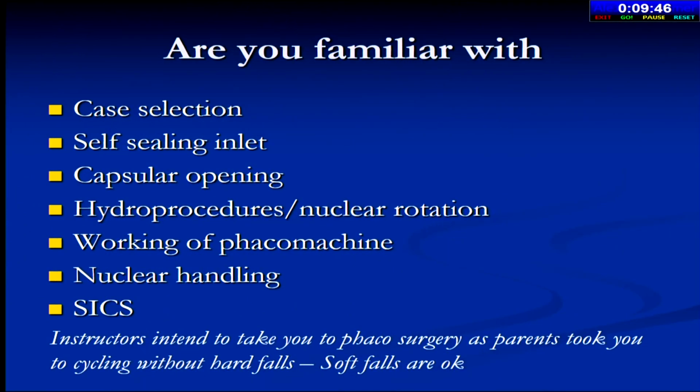And then you have case selection. You should know self-sealing inlet during SICS, capsular opening you must have learnt, hydro procedures, you must have learned SICS. Working of the Phaco machine, you must learn outside the eye, and nuclear handling. So SICS is this, which tells you all. Instructors intend to take you to Phaco surgery as parents took you to cycling, without hard falls.